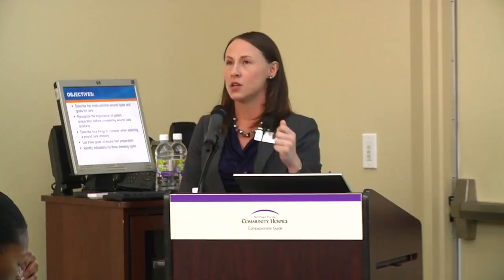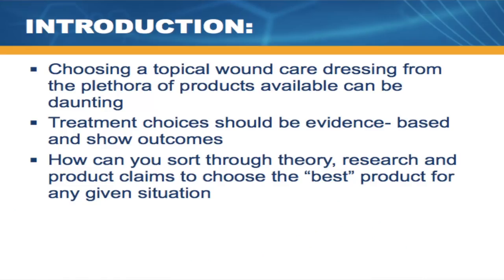When I first started doing wound care about 12 years ago, my mentor always made us not call those wound dressings by the brand name. We were not allowed to call that hydrocolloid a Duoderm because she said, tomorrow our purchasers are going to switch our brand and we're not going to know what we're calling everything and we're not going to be able to write our orders. It was the best lesson I learned at my first hospital, because we learned that a tissue is a tissue, not a Kleenex, and your copy machine is not a Xerox machine. It was a great lesson, and it carries over to wound care exactly.